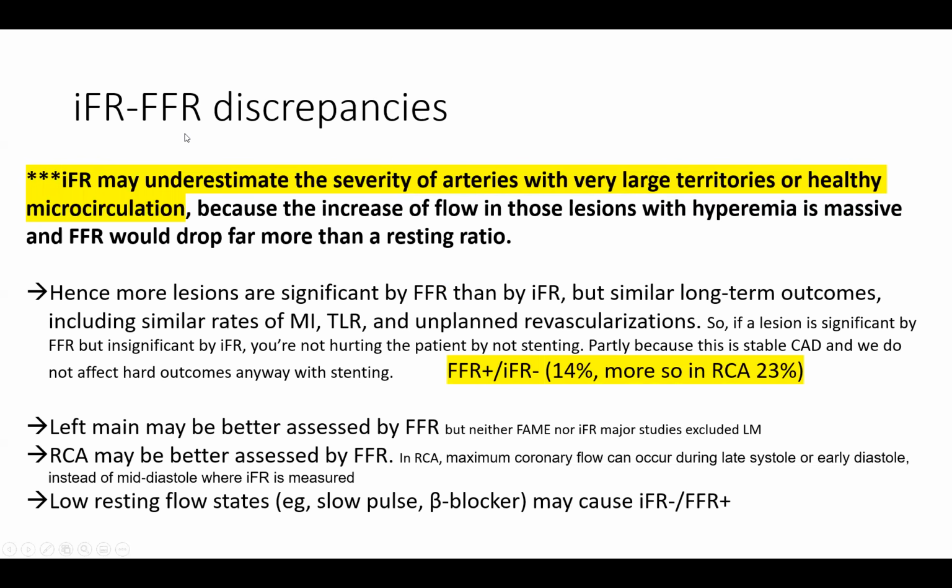So I will talk a little more here about iFR-FFR discrepancies, which is an interesting concept. Again, I described that clinically, even if they are discrepant, the patient will do well if you avoid stenting, based on those two trials and some other studies that I will show. But I still want you to understand those concepts and the discrepancy.